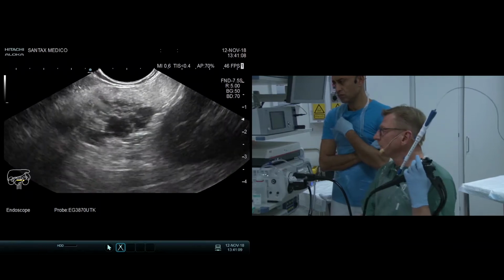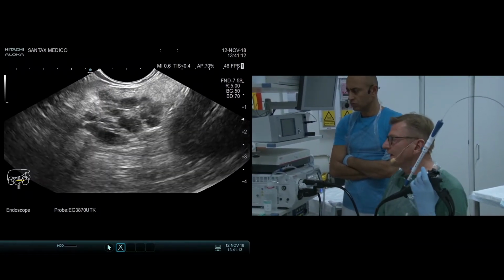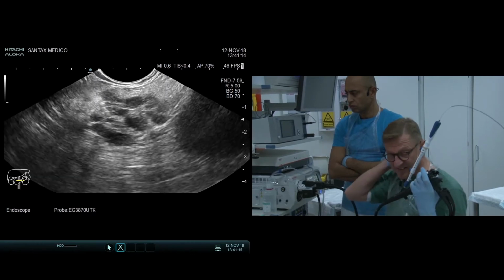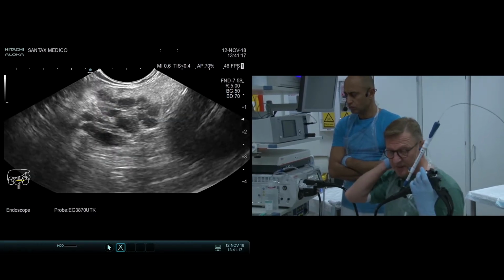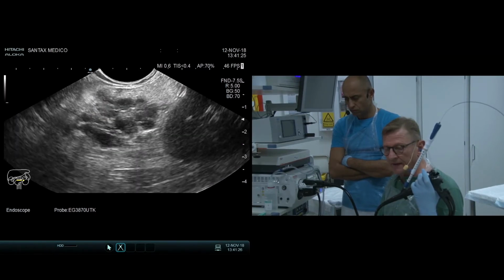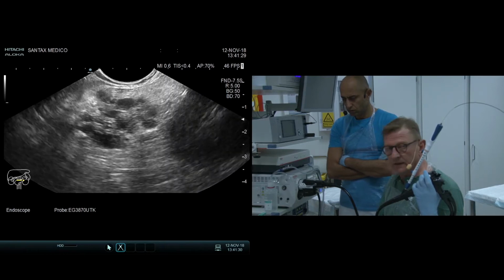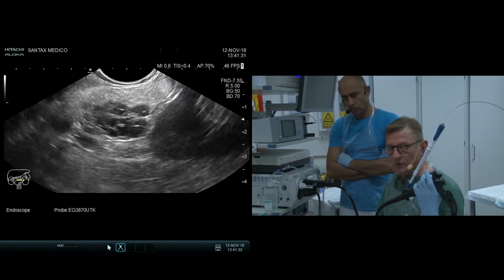So, you're right. Would you take some fluid initially, maybe do a string test and see if it's mucinous? But we will end by taking fluid out. Okay. In our experience, it's sometimes very difficult to get fluid, and if it is a serous cyst adenoma, we rarely get any good fluid for analysis.